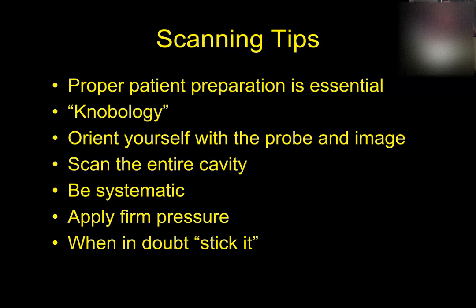If you go into the hospital yourself and they ultrasound you, there's a really good chance they're not going to scan your entire abdomen. Human medicine doesn't typically do that. And I think some of that is because of money, and some of that is because of time, and some of it's because we can tell the doctor what's wrong. We can tell them where it hurts. I've been having this clinical sign. Okay, well, we don't have that luxury with animals. And so I think because animals can't tell us what's going on, like what hurts or what the history is, then I think it's probably the right thing to do in almost every case to scan the entire abdomen.